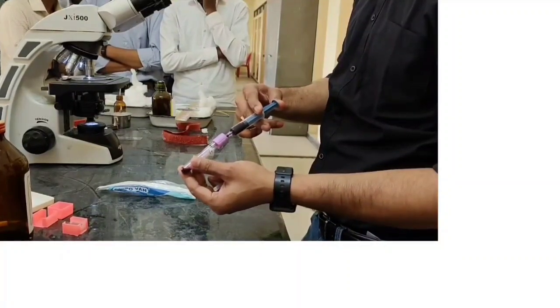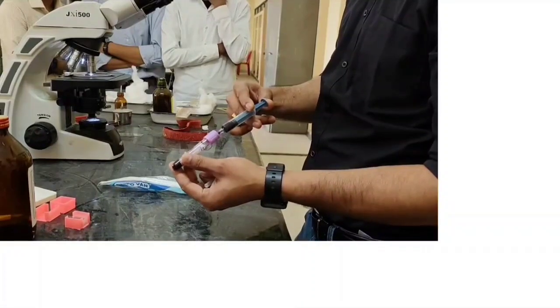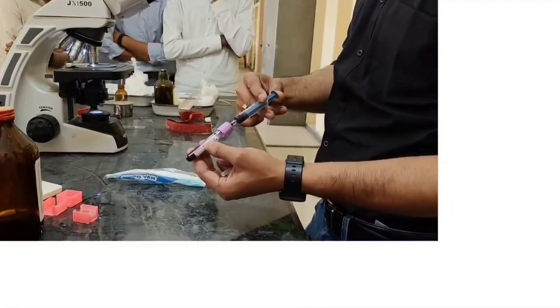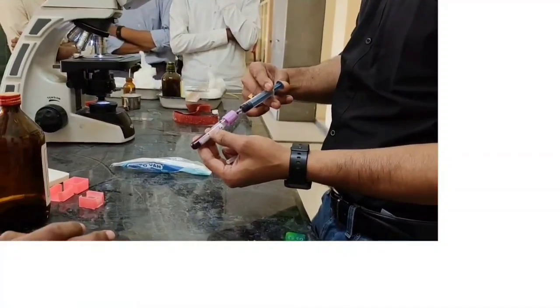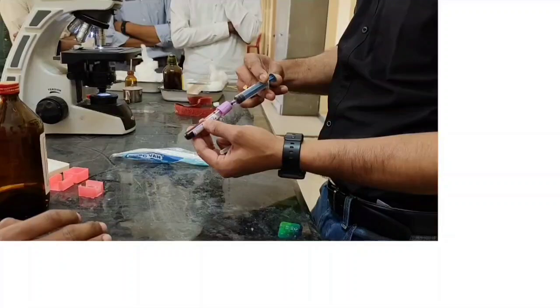If you get a vacuum vial, then blood will go automatically. You don't have to push. Okay, blood will go automatically with the vacuum. But here this vial is not a vacuum vial, so we are pushing it. But here we should be very careful to put it slowly, otherwise blood cells will rupture.